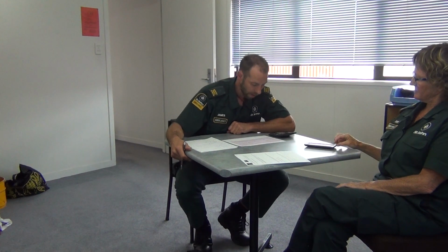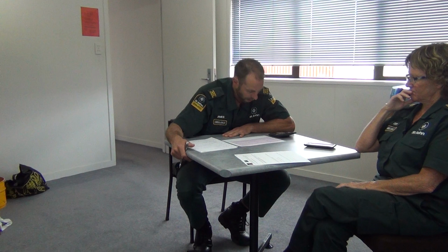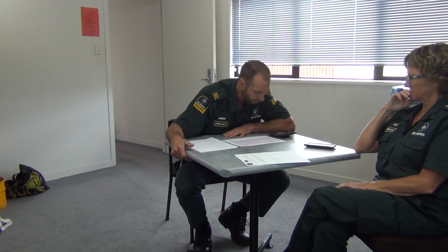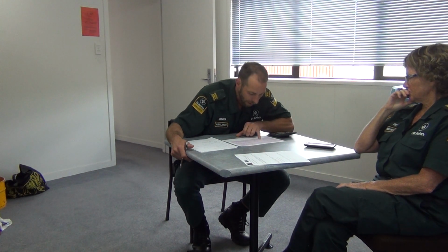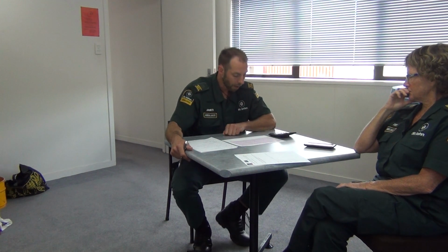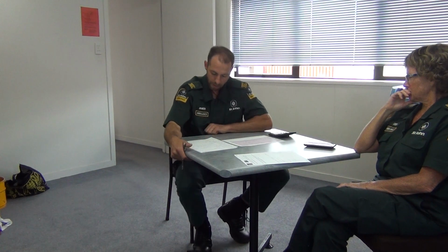Just noticing now that there are some Q waves which are very small in lead 2, 3, AVF, but none of them are a third of the R wave, and none of them are too wide.